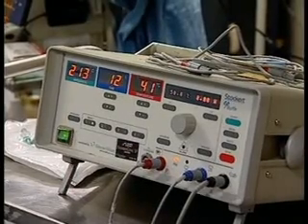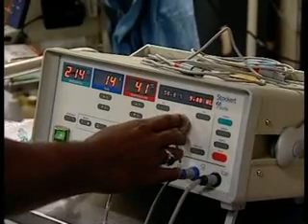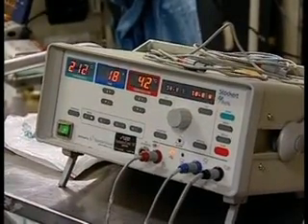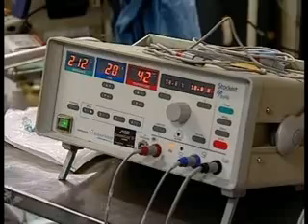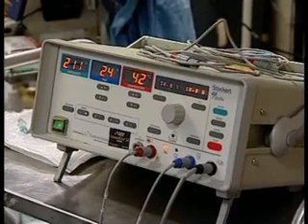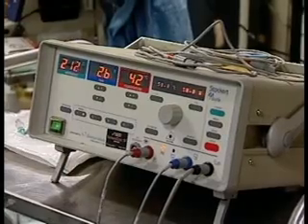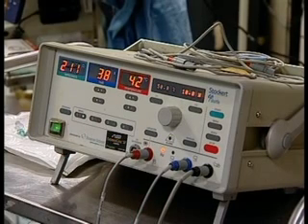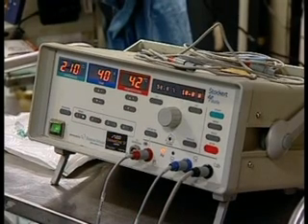Make it 10 watts. So what is the sedation protocol, Dr. Narasimhan? Because this patient has received, I'll ask Abhijit to tell you the details. He has received 2 milligrams. We have given him 100 mics of fentanyl. They have to be really adequately sedated because it causes a lot of severe abdominal pain at the time of delivering the energy. 100 mics of fentanyl, 2 milligrams of midazolam, and a fentanyl and propofol drip is going.